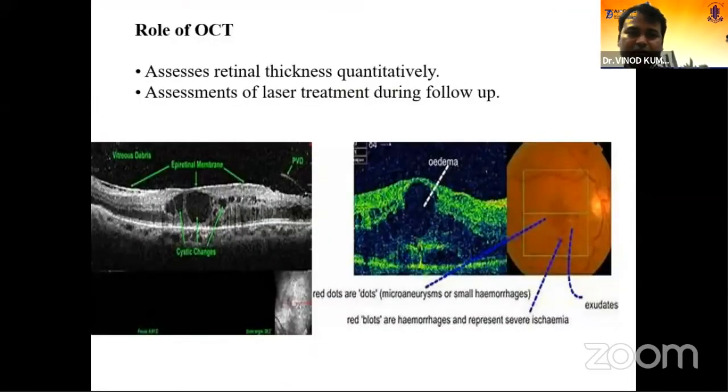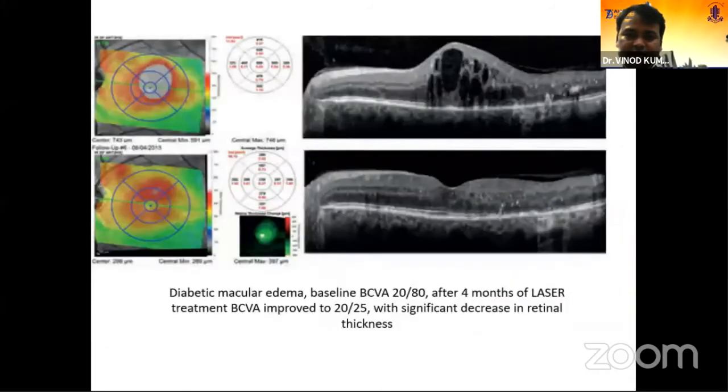Another important tool is OCT. OCT helps in two ways: it gives quantitative analysis of retinal thickness pre-treatment and post-treatment, and helps with follow-up of the laser. You can see before laser there were a lot of cystoid spaces, and after four months of the laser there is significant reduction in cystoid spaces and improvement in the retinal profile. It also helps with follow-up and you can show results to your patients.